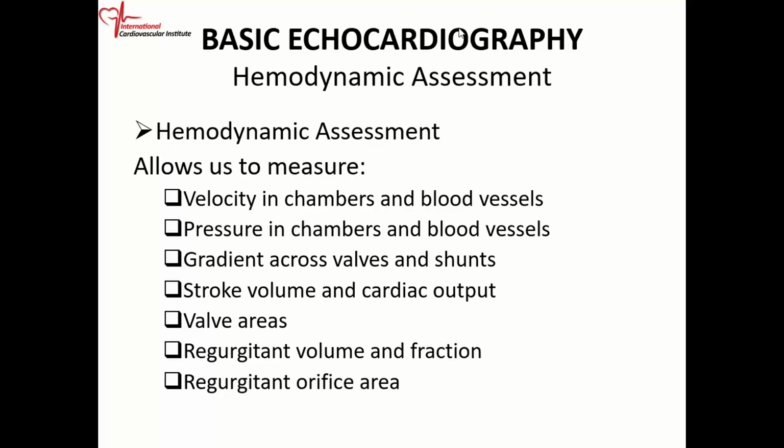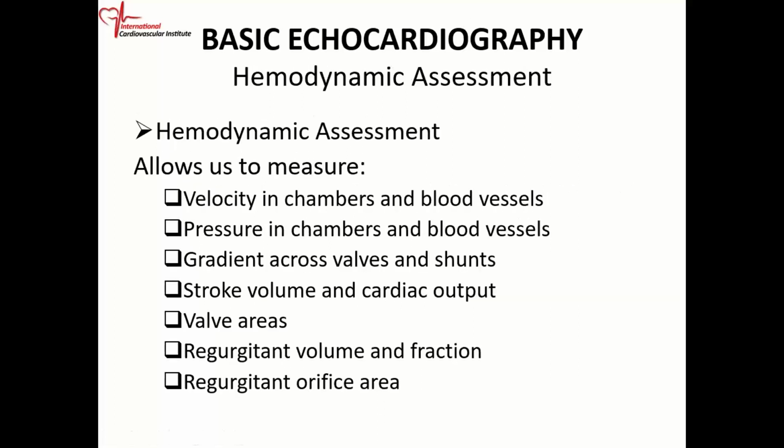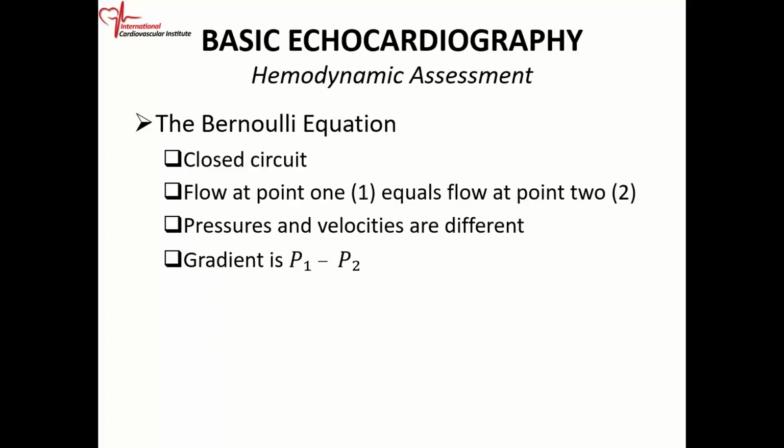So let's go into it in a little bit more detail. The first concept that we're going to look at is the Bernoulli equation. The Bernoulli equation allows us to calculate gradients.